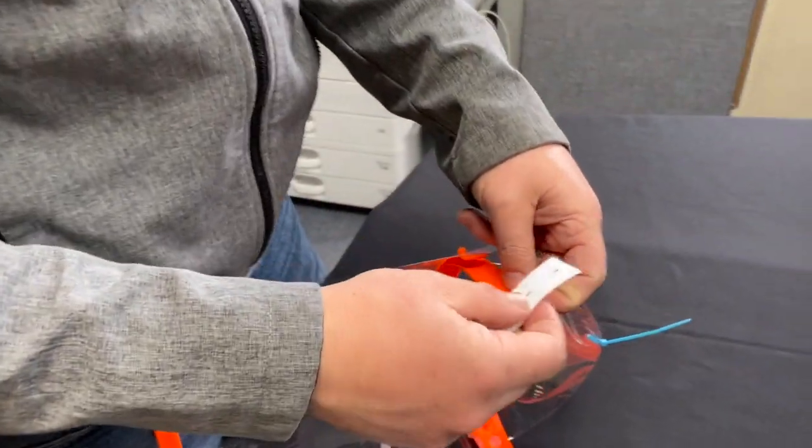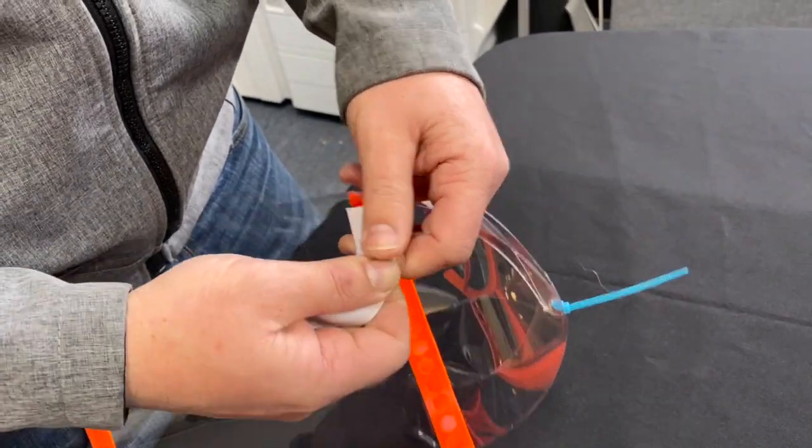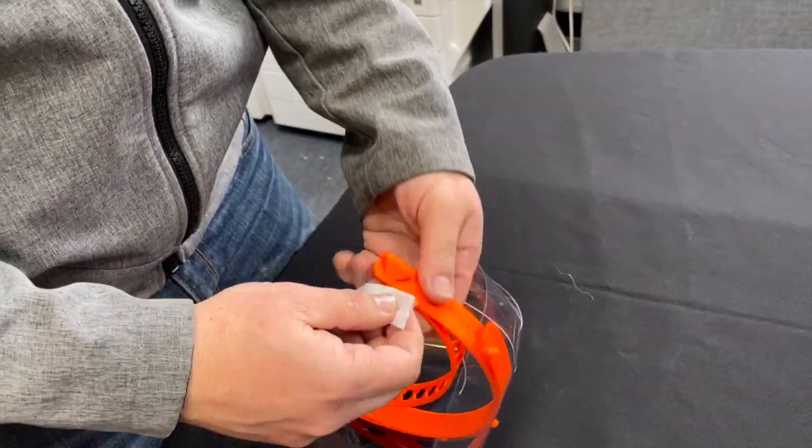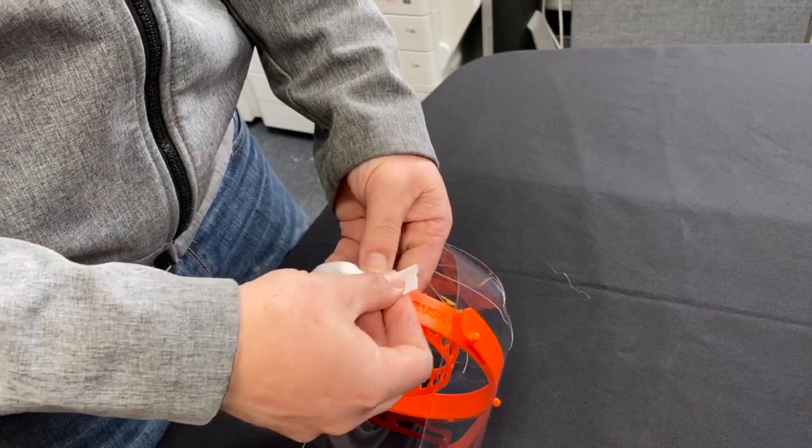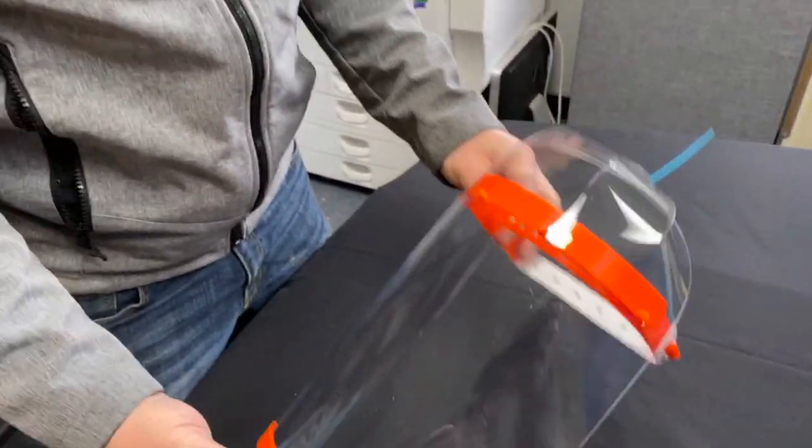Many types of elastic will work. This is buttonhole elastic. Just hook it in place and pull it over the far side. Hook the other side in place and pull it over as well and that's assembled and ready to use.